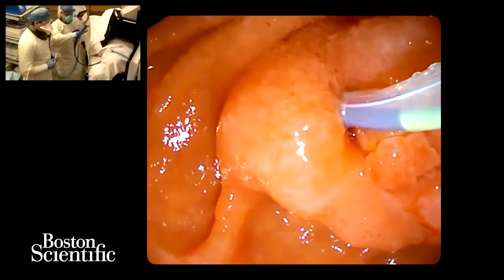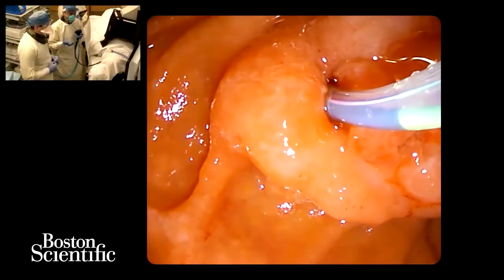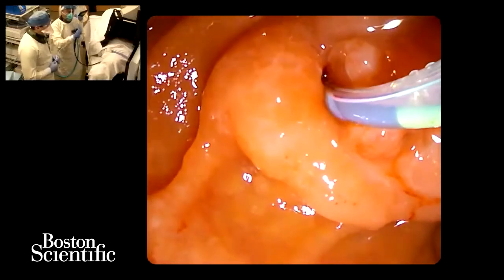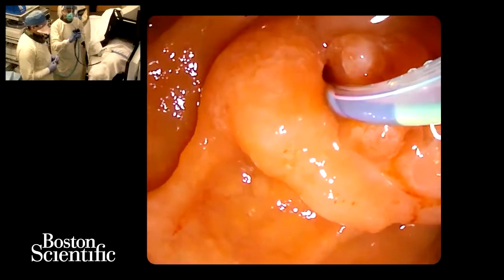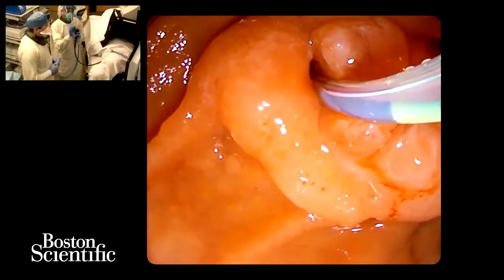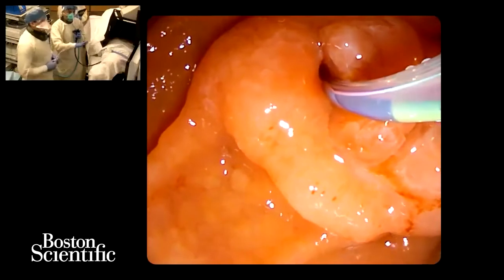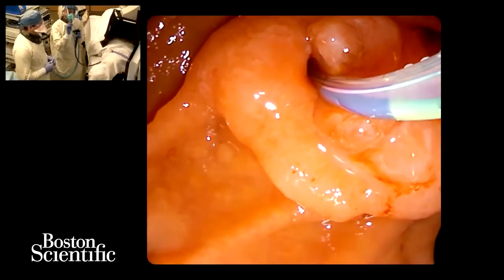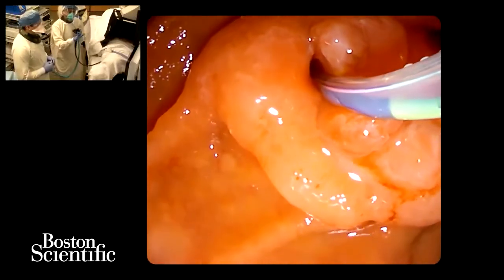So what happens right now is that in conventional fluoroscopy, when we perform our procedures, you have radiation or fluoroscopic exposure through the entire screen. But what AI or FluoroShield does is focus radiation only within the square. So the machine is programmed to track the place where the contrast injection happens, where the wire is going to be moving in, and whatever I will be doing is the only area where you will have radiation exposure. The surrounding areas around that white box will have no radiation exposure at all. But every 10 seconds, the X-ray machine will refresh the image around the square so that it remains fresh.